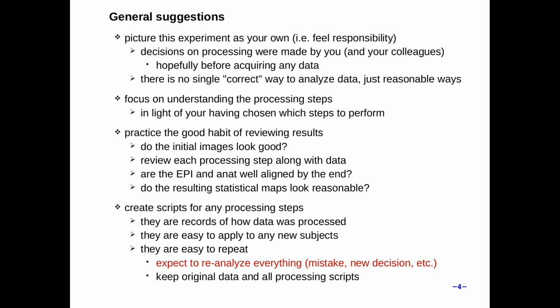You have to think about the data that is being acquired and make some choices about how is reasonable to analyze it based on that. Even for data in a known acquisition, you can still bicker about basically any pre-processing step endlessly. So for the most part, you want to understand the analysis well enough to feel justified in the choices that you have made for processing. So for now, we'll focus on understanding the processing steps given the choices that were made.